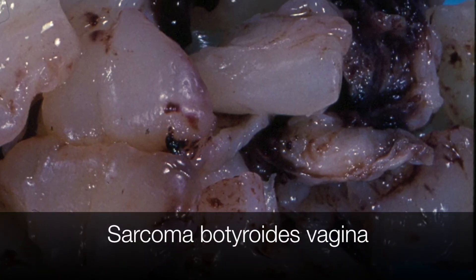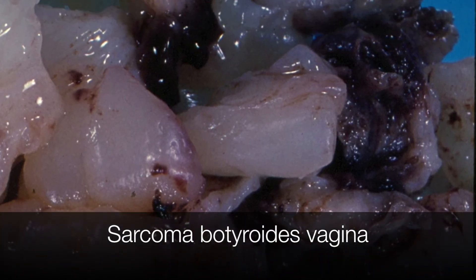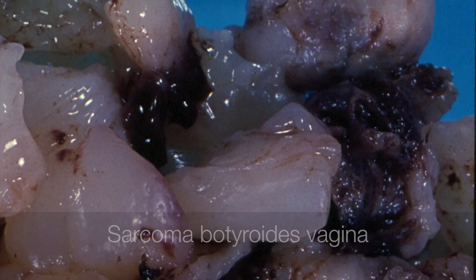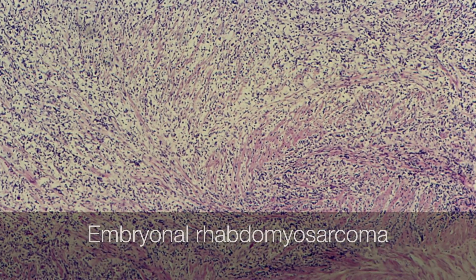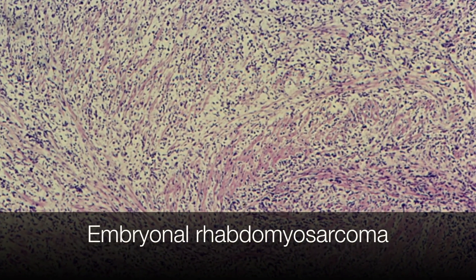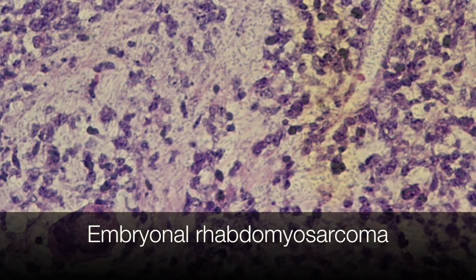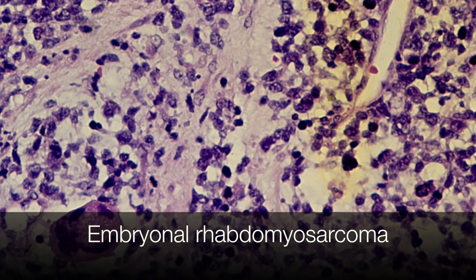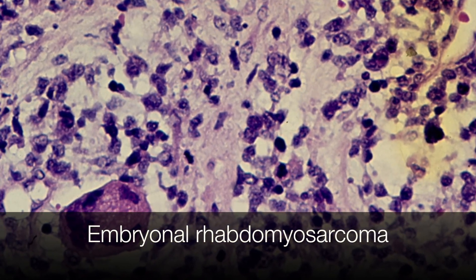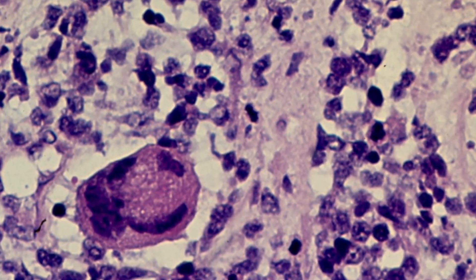This is an example of sarcoma botryoides and it is an embryonal rhabdomyosarcoma of the vagina. This is the corresponding histology with sheets of undifferentiated small round malignant cells, but in the bottom left hand corner you can see a cell with abundant pink staining cytoplasm.